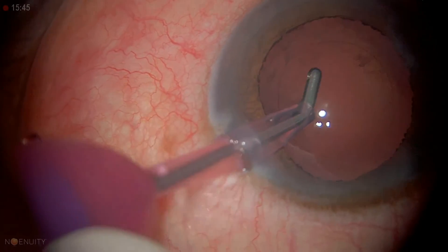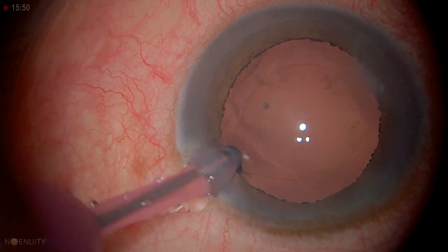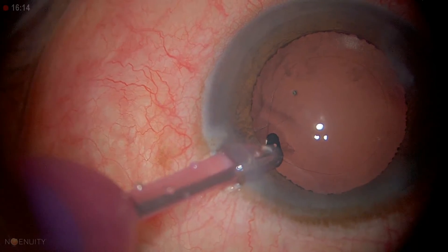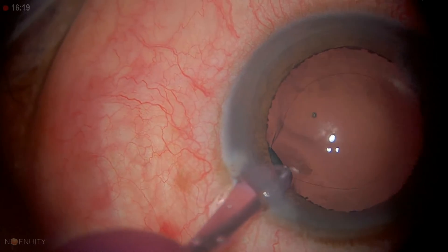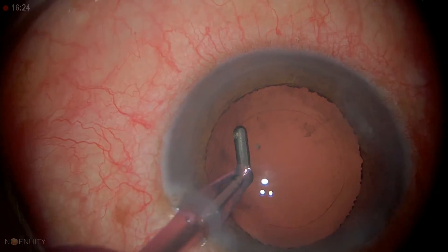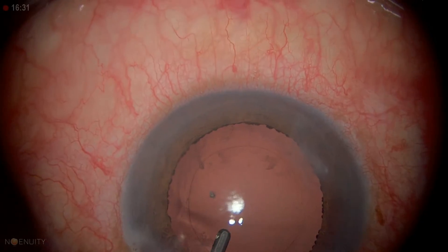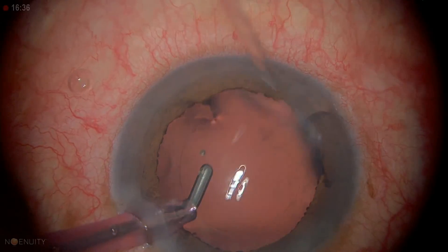That's very good. We have a little bit of sub-incisional cortex — just a little — and I can't quite get it out. This is the kind of cortex that you sometimes decide it's safer to leave than to try to remove.